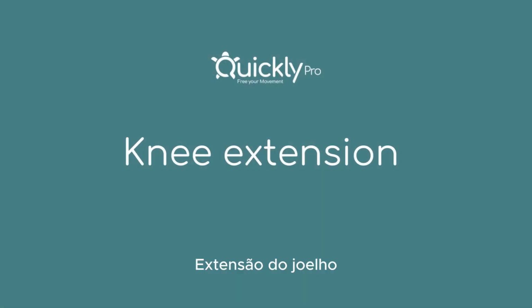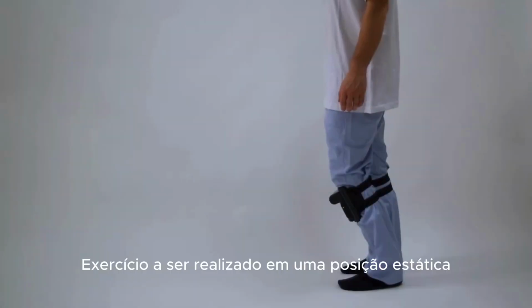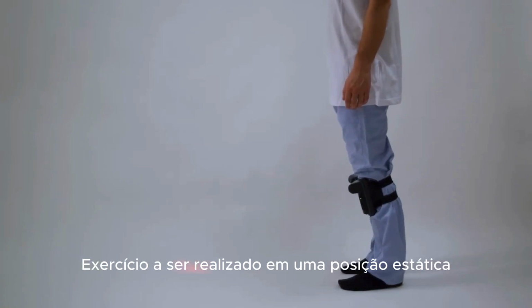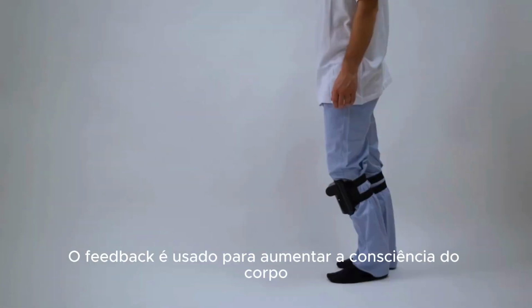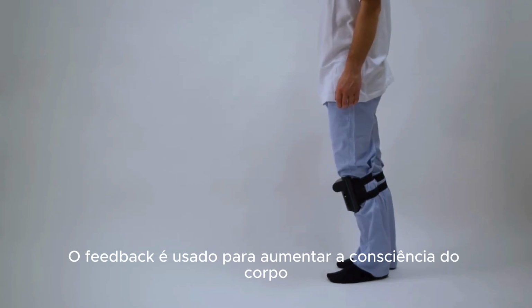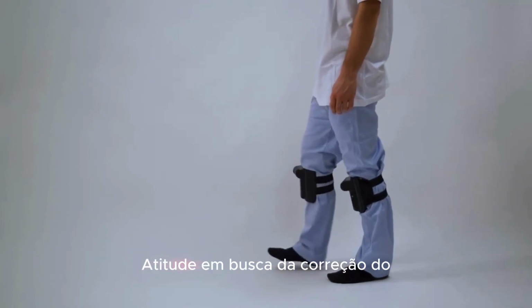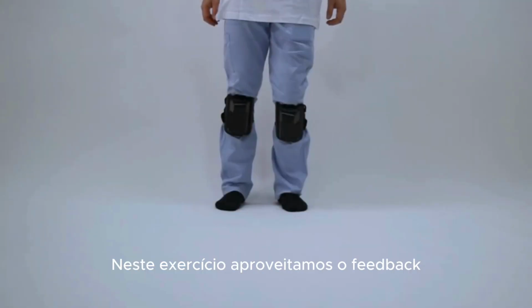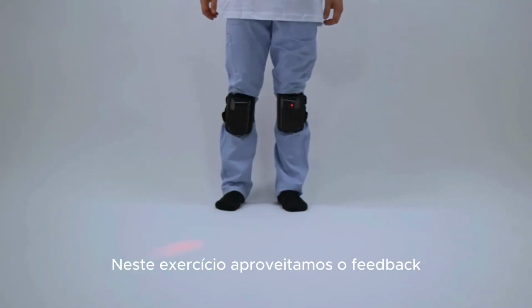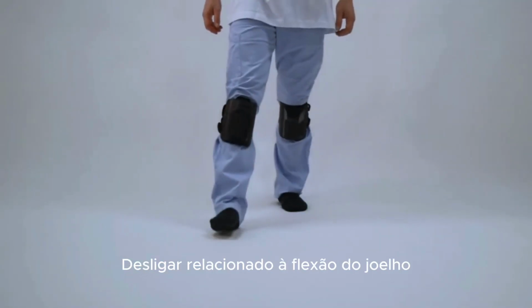Knee extension. Exercise to be performed in a static position, so the patient is not required to advance. Feedback is used to increase awareness of the body's attitude in search of correction of the compensatory attitude of knee flexion. In this exercise, we take advantage of the feedback switch off related to knee flexion.